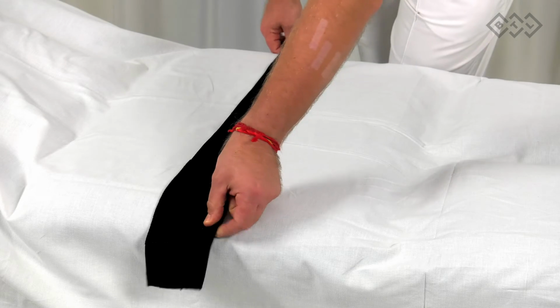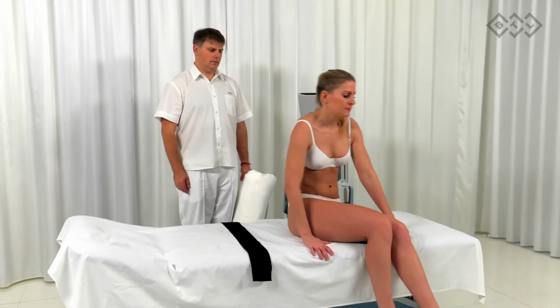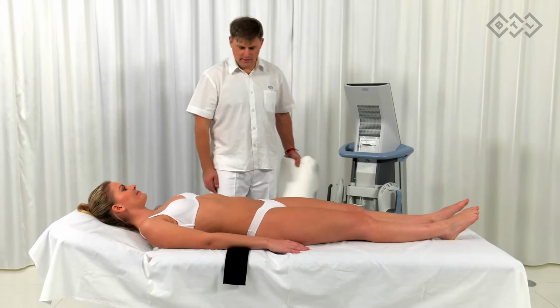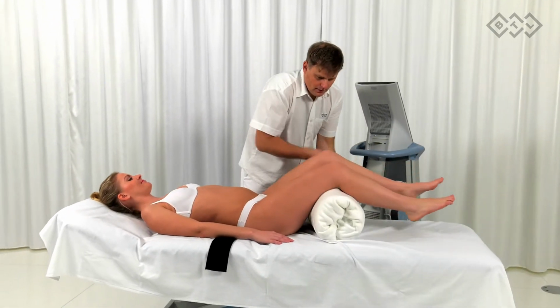Place the fixation belt on the bed. The patient should remove clothing from the treatment area. Have the patient lay down flat on their back. You may want to place a bolster below the knees to relax the abdominal muscles and lumbar spine.